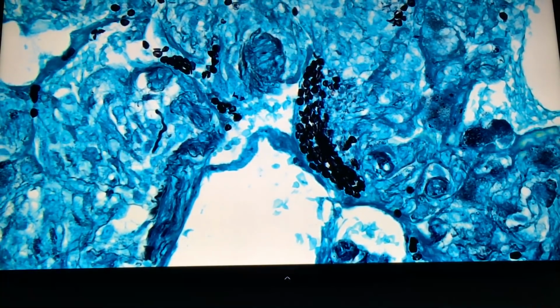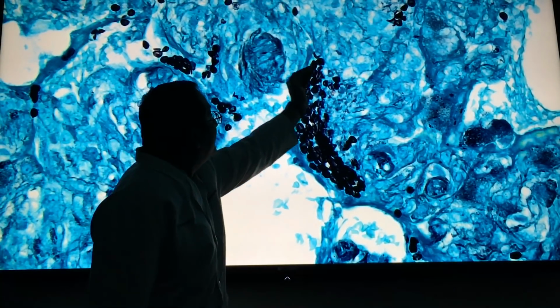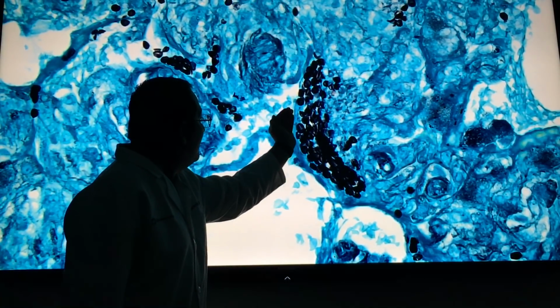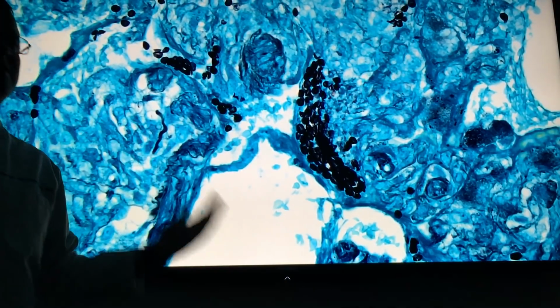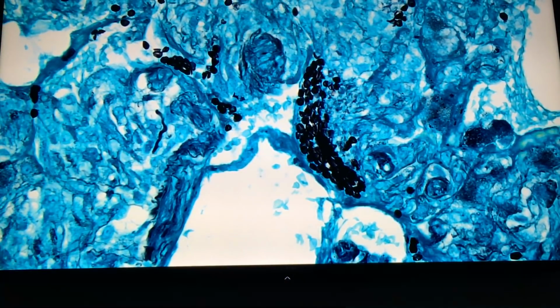See that, guys? The characteristic thing is these crescent shapes, or a crushed ping pong ball appearance, crescent shape like that. See these. And if you combine this with the frothy appearance, there's no differential to this. This is absolutely diagnostic. Okay, now go back, Aaron, go back to Lomac. On the H&E? Yes, I'll give you another slide.